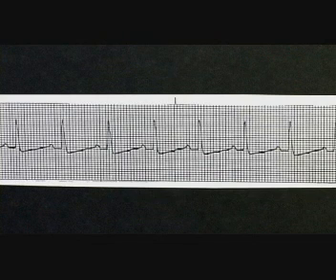Now, measure the QRS complex to see if impulses are conducted through the ventricles at a normal rate, which is less than 0.12 seconds. Then, determine whether T waves follow every QRS complex and whether they all look alike. A tracing that is normal in all these aspects reflects normal sinus rhythm. On our example, these components are normal and the rate is between 60 and 100, so this is normal sinus rhythm.